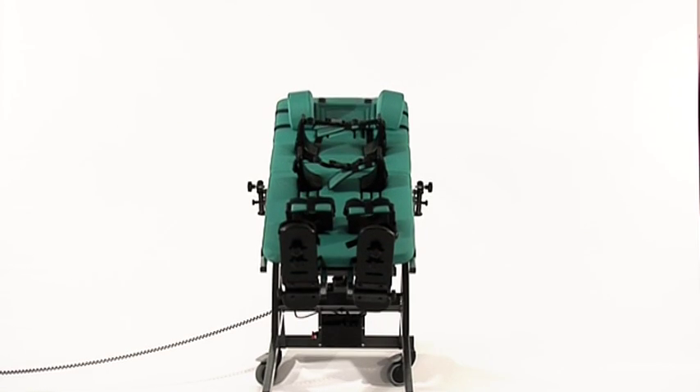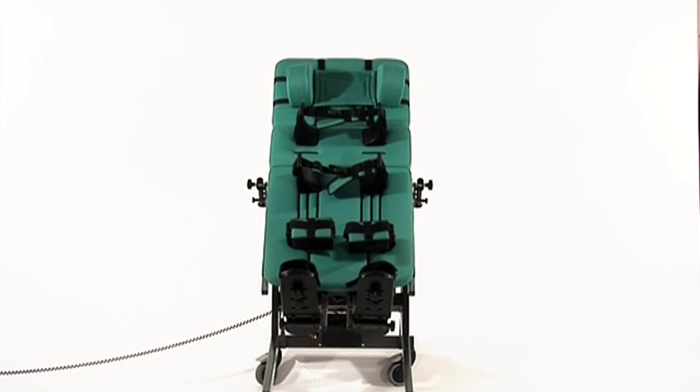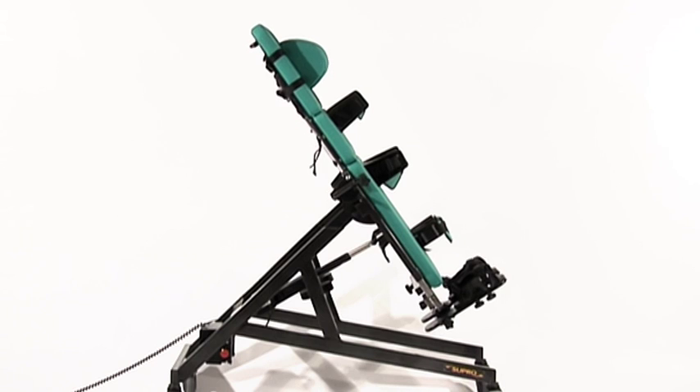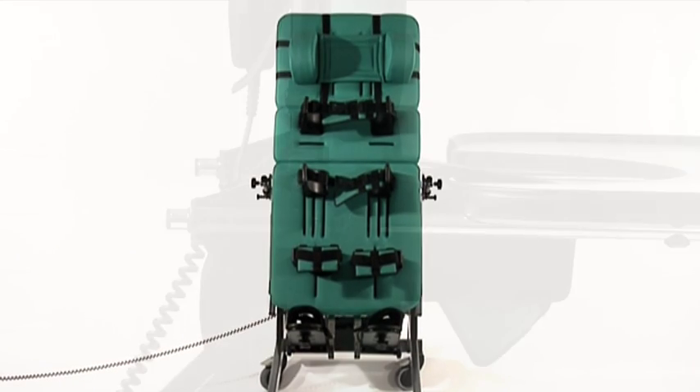The Supro provides the option of supine, prone and vertical standing in one frame. Its design gives an angle range of 90 degrees, allowing it to achieve a horizontal and vertical position.